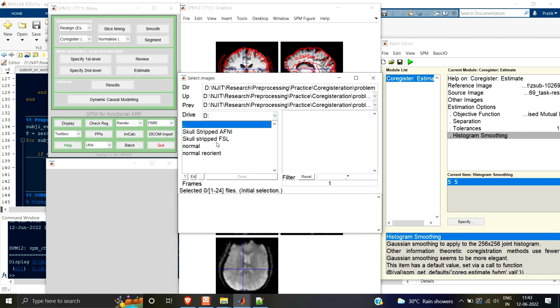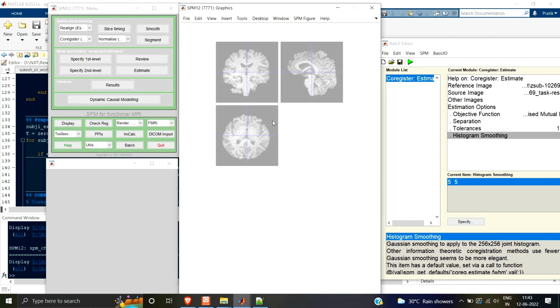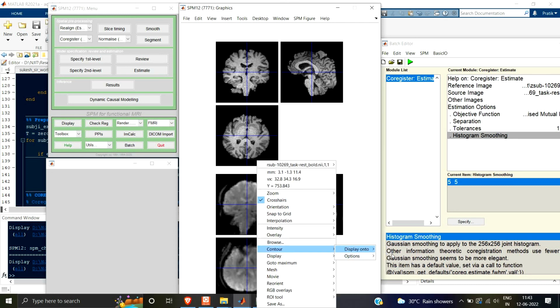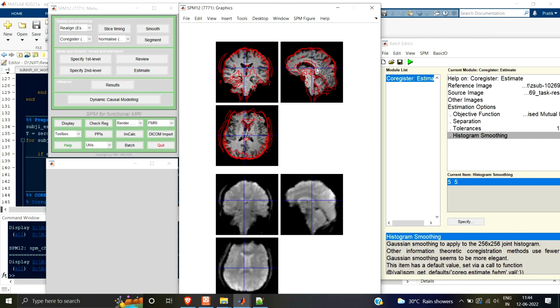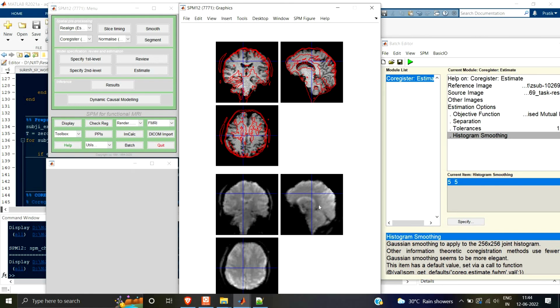I've done that. So with FSL, so here is the FSL. I've aligned the FSL anatomical image with the rest image. So this is the FSL skull stripped image. Yeah, you can see it has done the job. It is more or less okay, but that does the job. So this is how you can do it with AFNI and FSL.